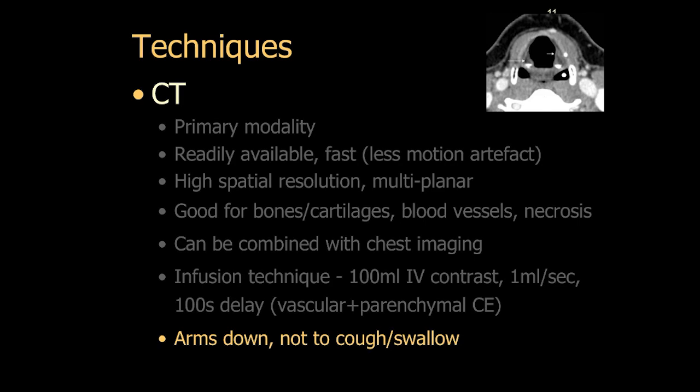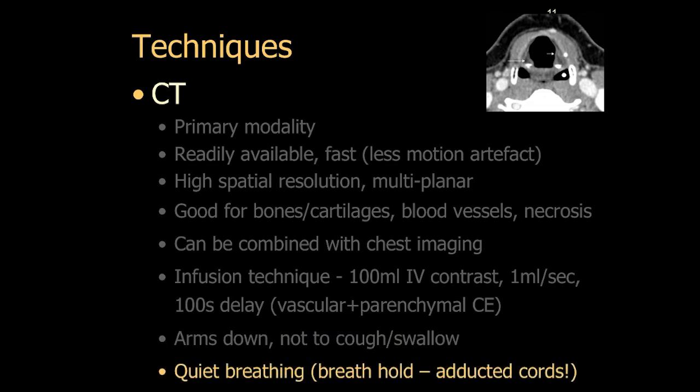For the neck, we instruct the patient not to swallow, cough, and also to breathe quietly and not hold their breath during the scan. Breath holding will result in adduction of the vocal cords, and you will see a closed glottis on the scan, which can make interpretation quite difficult.